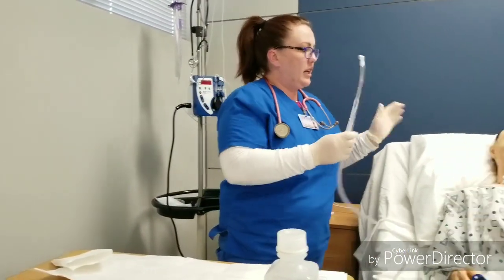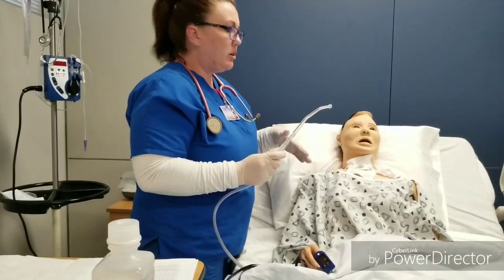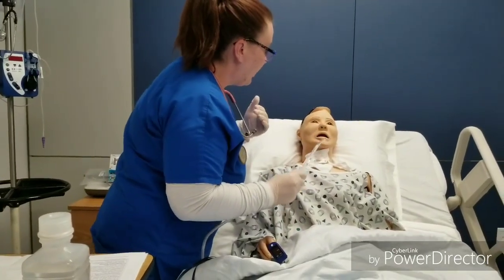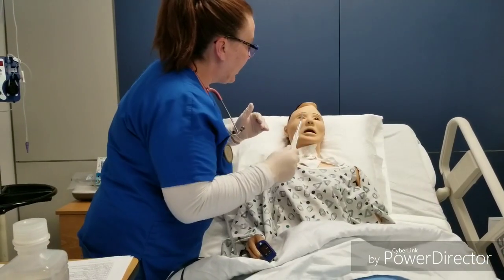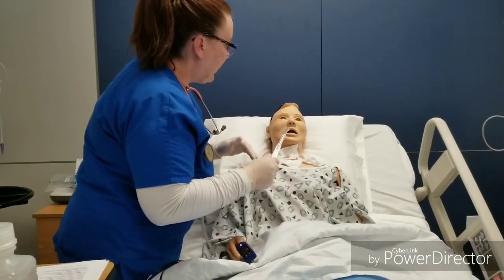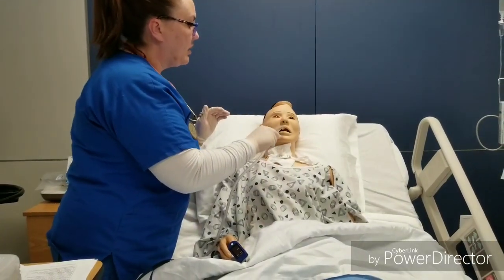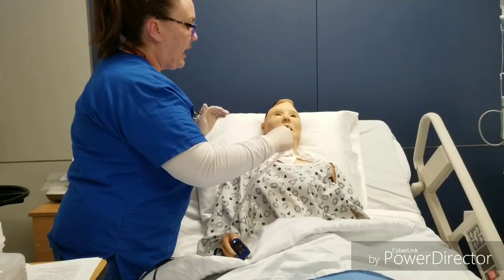Make sure the patient's head of the bed is sitting up and the patient's comfortable. Explain the procedure. Mr. Smith, I'm going to now suction in your mouth. I'm going to go side to side and in the back of your throat. You let me know at any time if you are uncomfortable. Patient opens mouth, go to one side, other side, and the back.